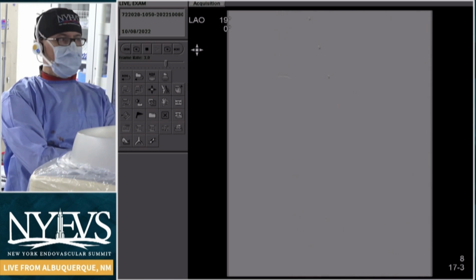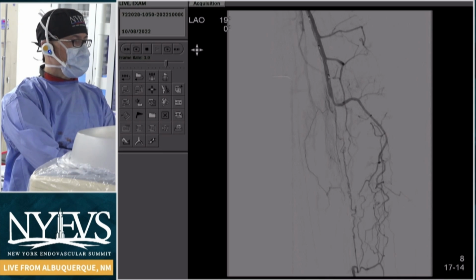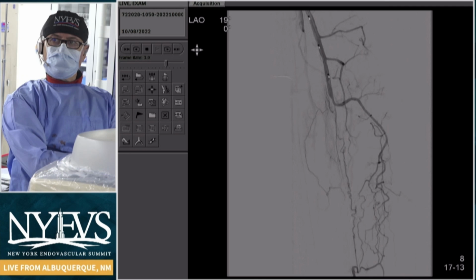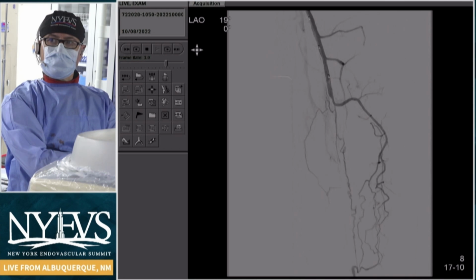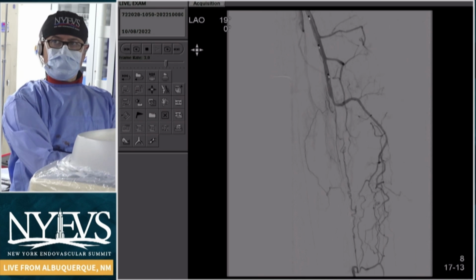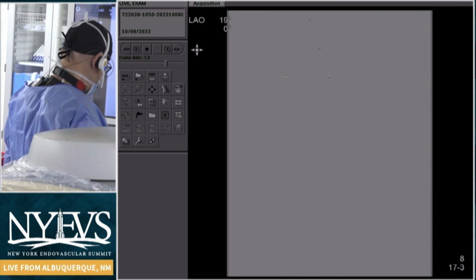Yeah, I think that's just it. It depends what the IVUS shows. I think Dr. Finelli has shown that the calcification is going to be a predictor of outcome depending upon what technology we use. So once we see the IVUS, you'll get not only the constituency, the plaque and the plaque morphology, you'll get the sizing. And those are the two important parameters that I think are going to dictate what we do next. Yeah, I think everybody's in agreement here, Steve, in terms of what the IVUS shows in terms of plaque composition and degree of calcification and so forth.